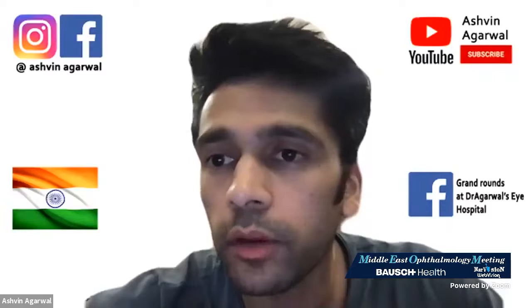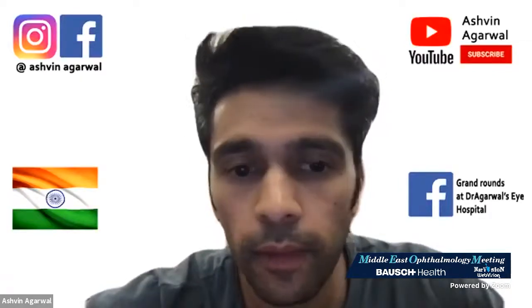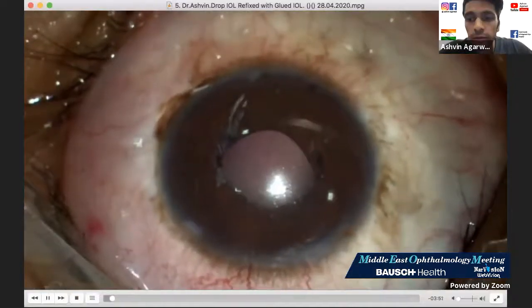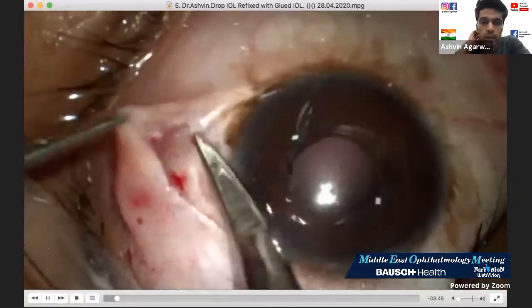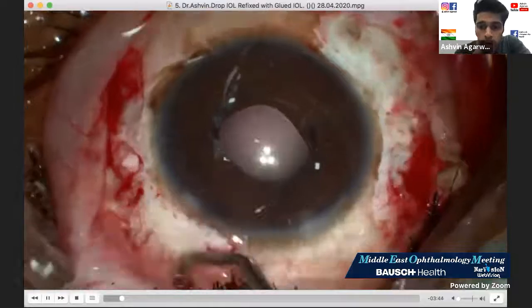Go ahead, yes, please. I'm just going to show one more case, and then I'll take all the questions in one shot. So this basically was a glued IOL done earlier, and it did have a complication, and I will show you the lens had dislocated. It was a long back done, one of my first few cases where I did not understand the importance of the white to white. The white to white was larger.